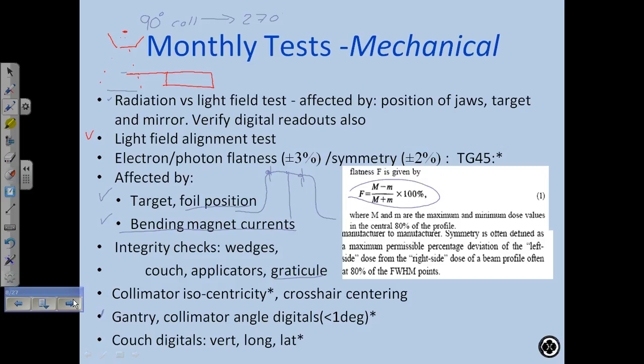I've just done the Accelerator QA. Okay. Any Linac QA? We're going to do Tomo soon, but we keep getting caught up with things last minute with these add smart flags. They come in and then plans just don't come through. So we're doing QA at 6:30 tonight.